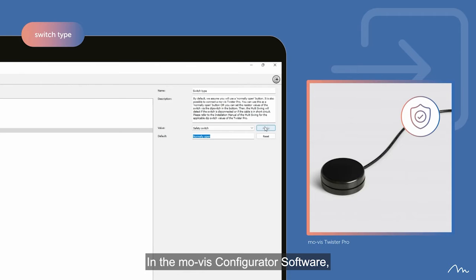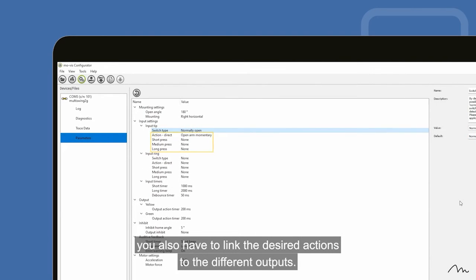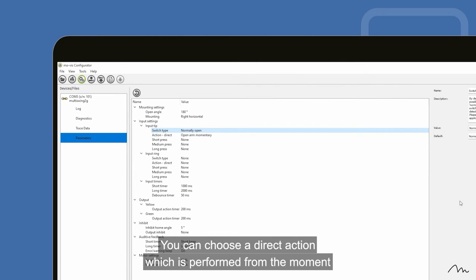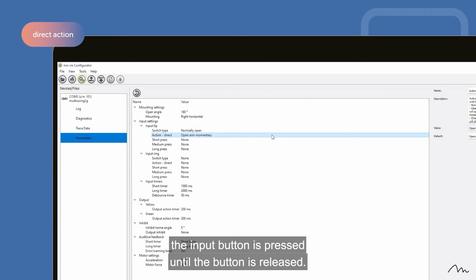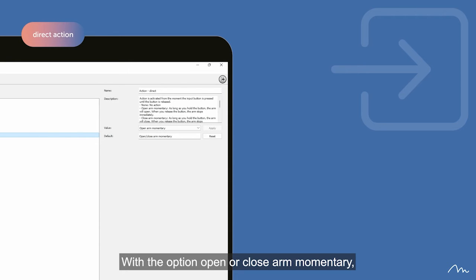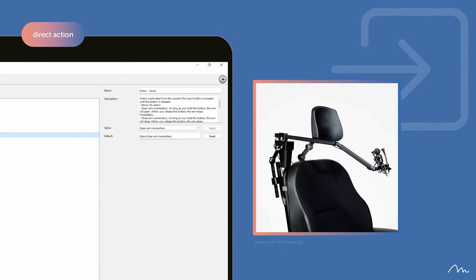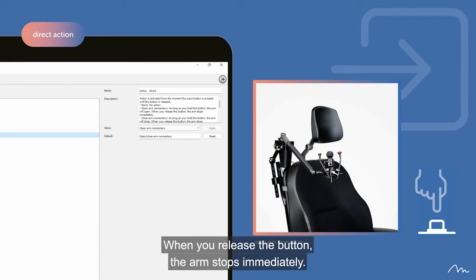In the mo-vis configurator software, you also have to link the desired actions to the different outputs. You can choose a direct action, which is performed from the moment the input button is pressed until the button is released. With the option Open or Close Arm Momentary, the arm will open or close as long as you hold the button. When you release the button, the arm stops immediately.